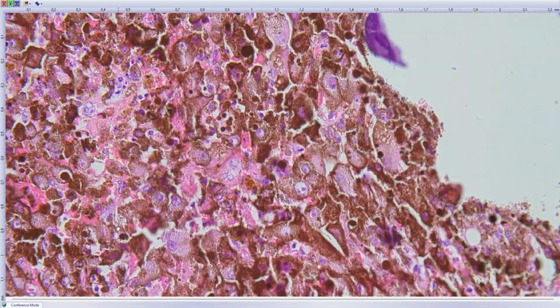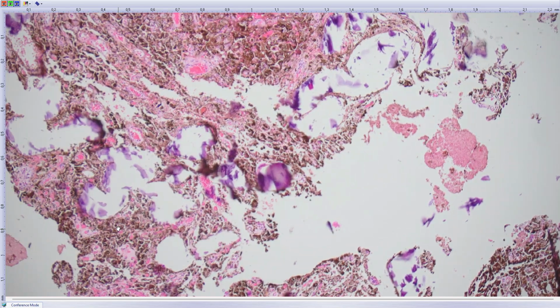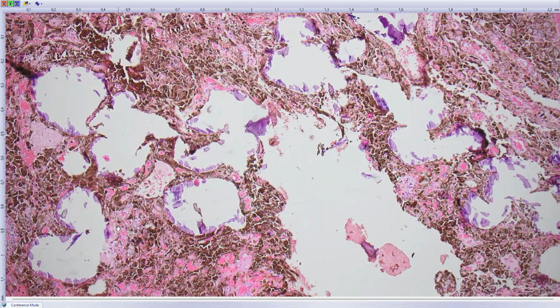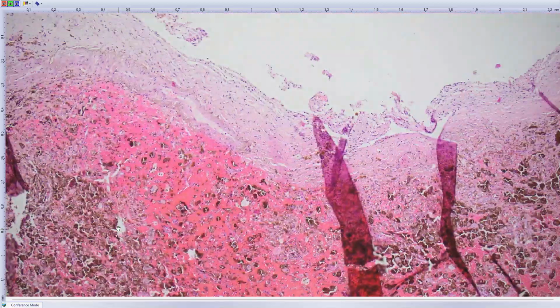And so if you see this combination of large epithelioid cells, heavily pigmented neoplasm, and also, especially if you have these calcifications, which in some foci have a psammomatous appearance, especially if you see it in this location around the spinal cord, this is highly suspicious for a tumor that was formerly called psammomatous schwannoma. It was originally thought it's a variant of schwannoma, but it's not. I'll say more about it right away, but let's look at what can help us.